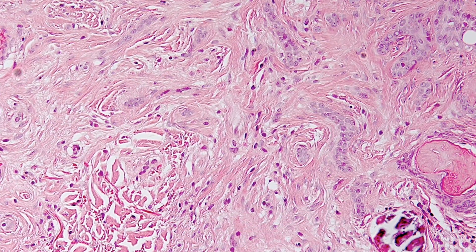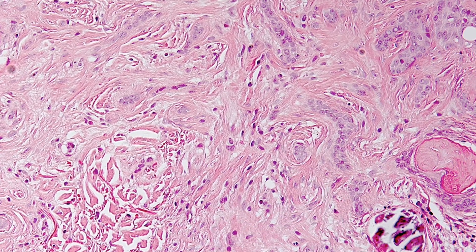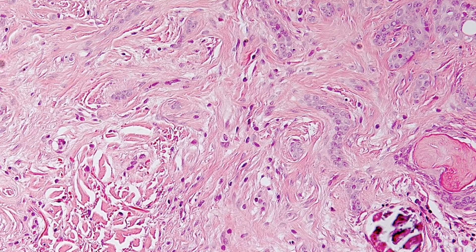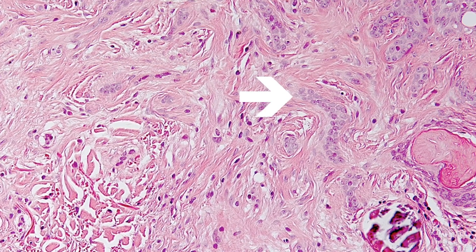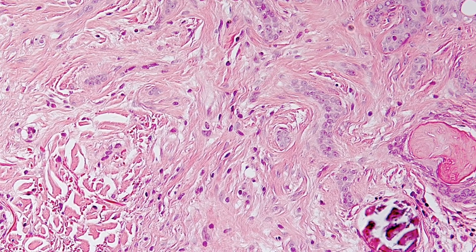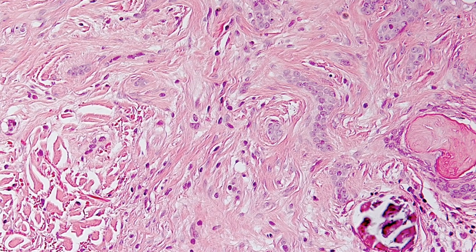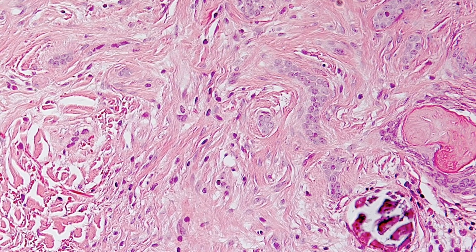And on even higher magnification, the rather bland nature of the basaloid cells forming strands can be appreciated. The stroma is clearly desmoplastic, composed of dense fibrous tissue.